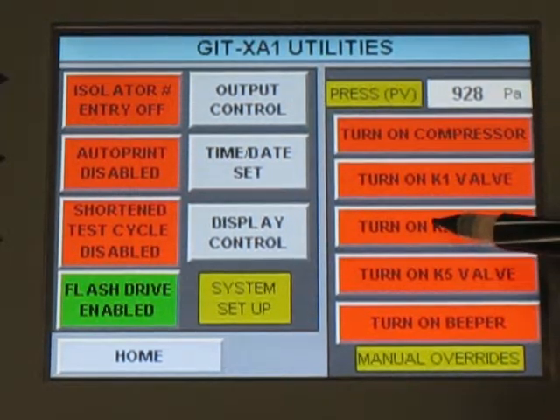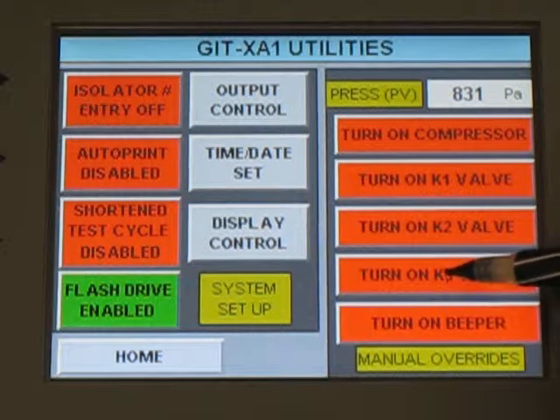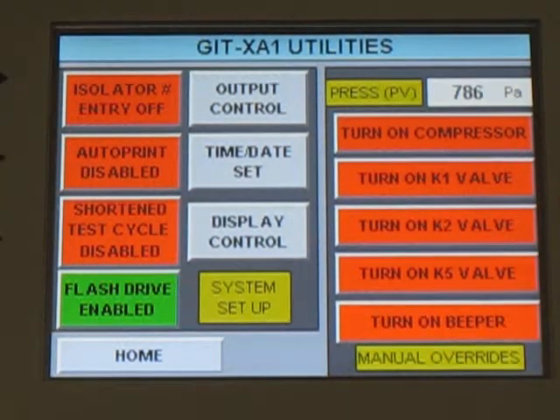I can deflate it very quickly by turning this on. See that's dropping very, very quickly. But if I turn this one on, it's going to drop much more slowly, as you can see. And of course, I can turn on the beeper. So that's a demonstration of the functions of the machine. These functions will be used by a mechanic if, let's say, the machine looks like it's not working well. Then those functions can be used to manually operate it and investigate.